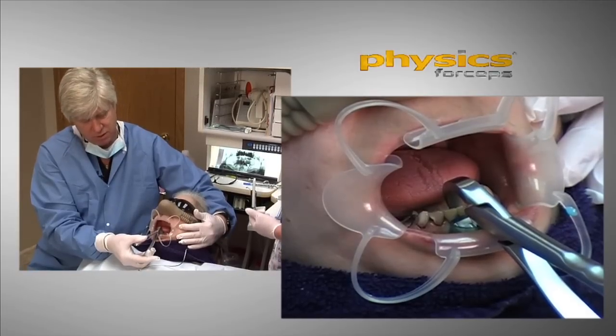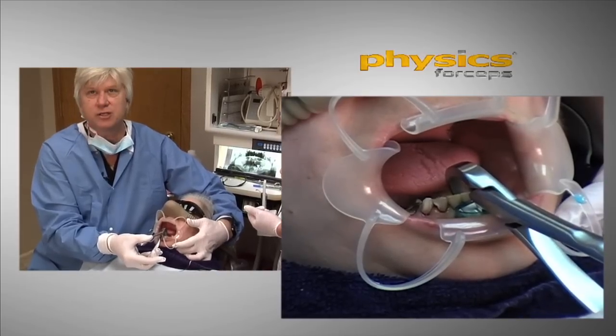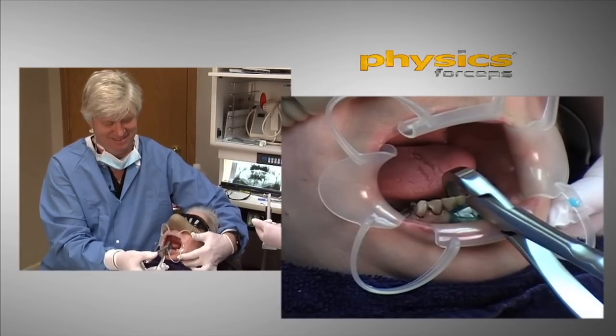Gotta take your time here. Can you lift your chin up just a little bit for me? Just give me a little more room there. Not really putting a lot of pressure at all. Now I felt the tooth. You can see it starting to move a little bit.